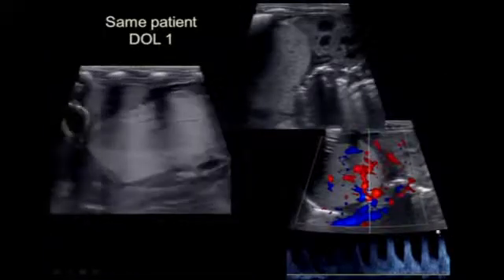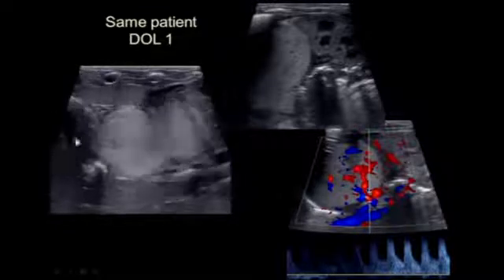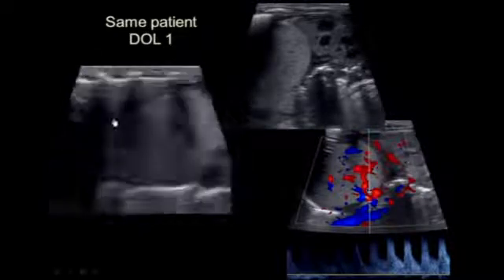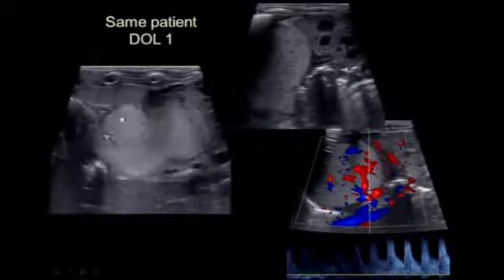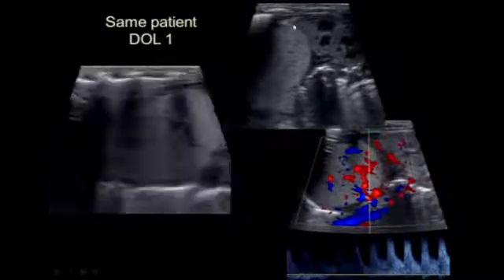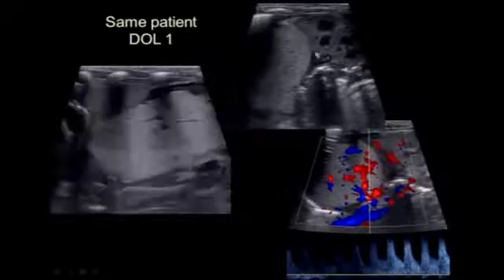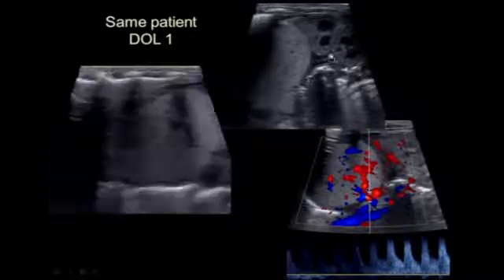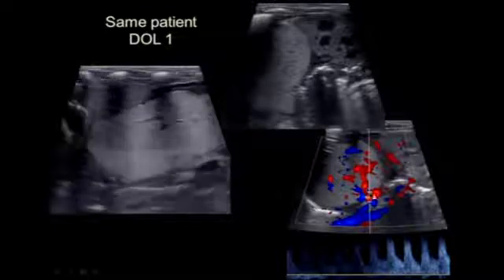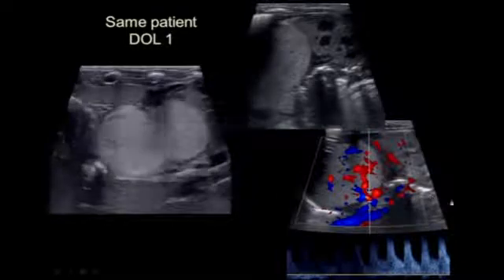Here's this same patient on day of life 1, and now the fetal head is to the left. These are the lungs, and you can see here's the spleen, and here's this echogenic lesion, pretty easy to see, with a beautiful left kidney, not part of the lesion, a very discrete plane between the lesion and the kidney, and also a beautiful adrenal gland tucked in here, completely normal in appearance, again, with a discrete plane separate from the adrenal gland, and still the systemic blood supply coming off the aorta into this infradiaphragmatic sequestration.